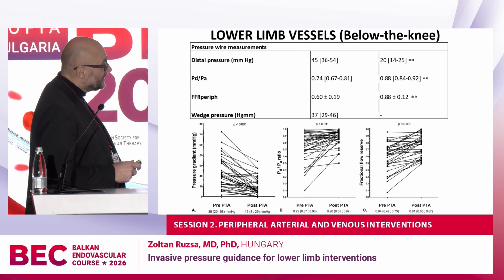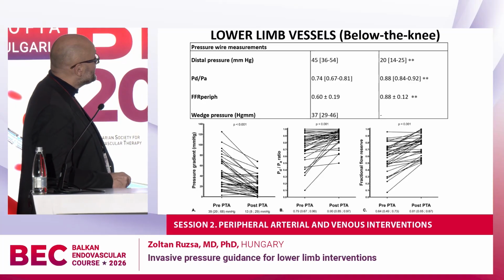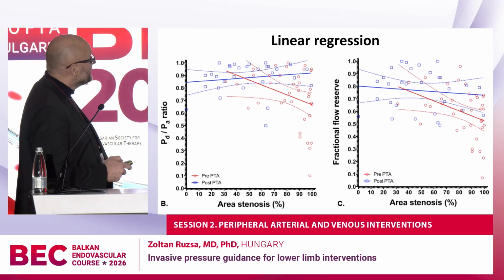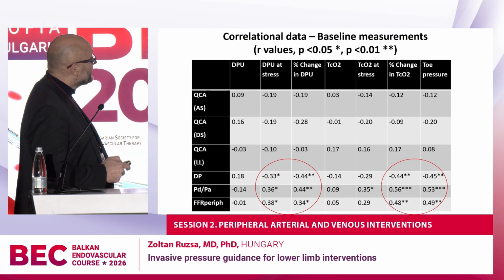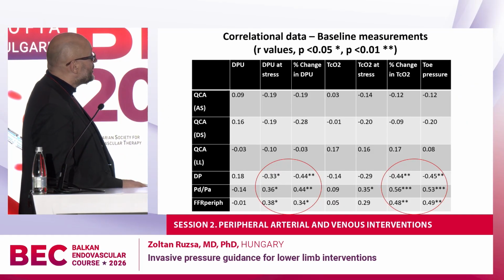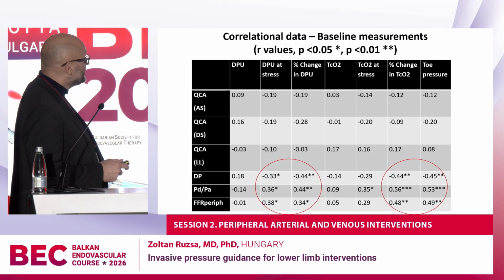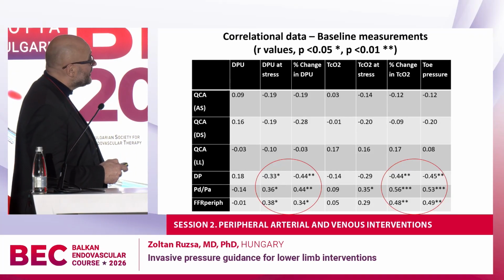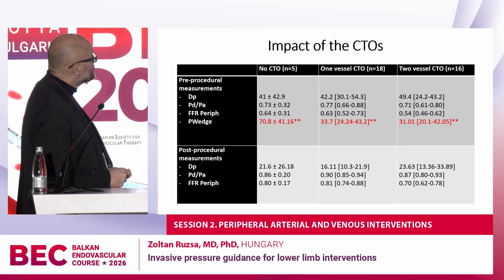The patient had recovered, also the wound has been healed. The pressures have been improved after the intervention, also the FFR in this study group, and there was a nice correlation with the area stenosis before and after the intervention. Also, we correlated with the laser Doppler, so it was a nice correlation between the pressures and the laser Doppler parameters during the intervention. And these are the wedge pressures.